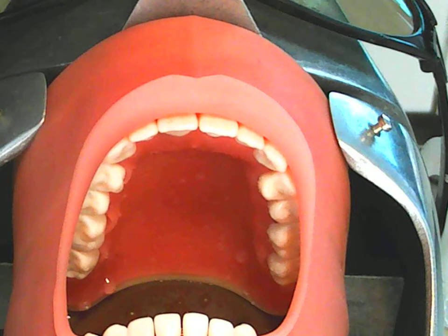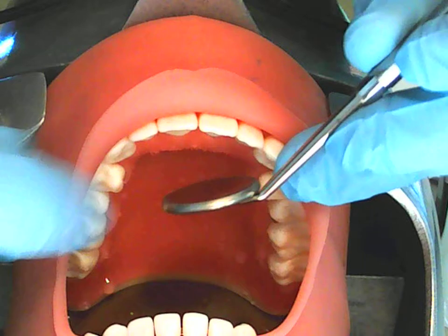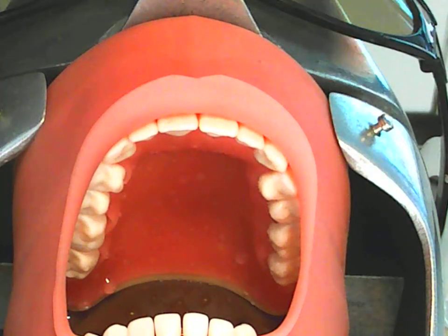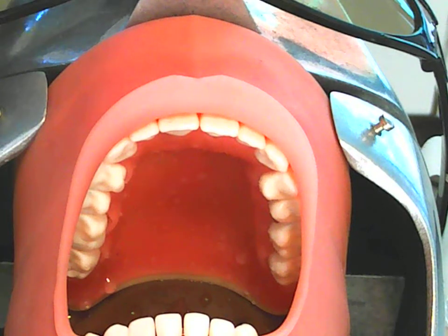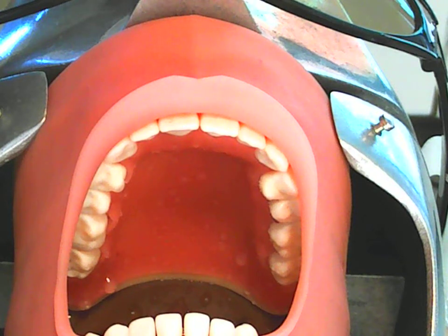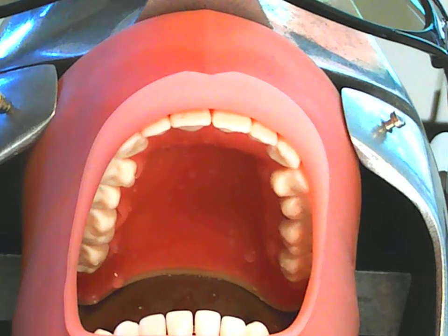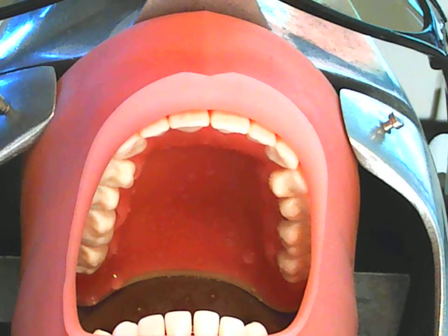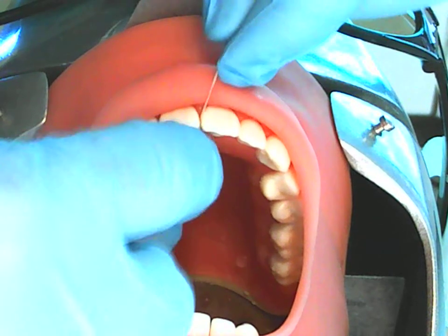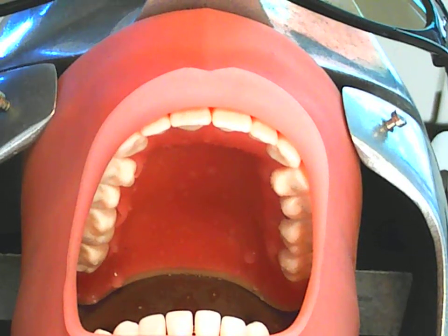Okay, so quickly examine the treatment area. We know that it is for the 2-1, but we want to see if that tooth is rotated or any complications that could arise throughout your application you want to be aware of first. Okay, looks fine, nice and straight, shouldn't be a problem. If you feel you want to floss that area, please go ahead and do so. If it looks like there's maybe a bridge or a crown there, but in this case it's a single tooth, so no complications, and I confirm that by flossing.